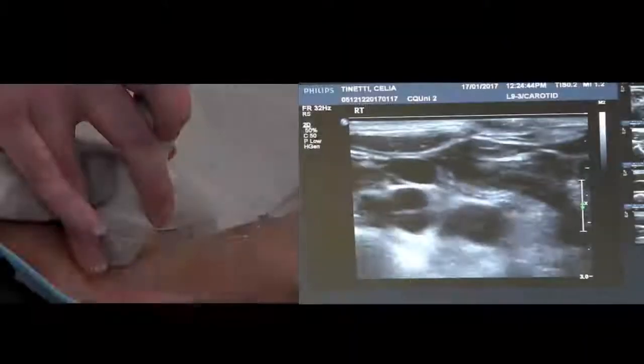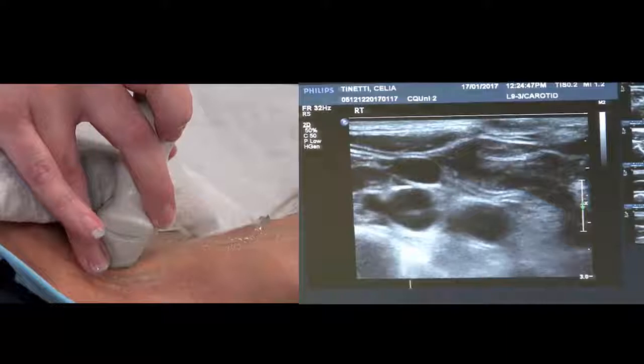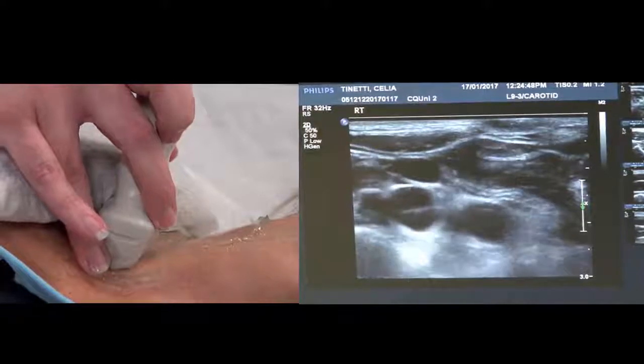This second video of the three will be continuing on from the first one. We've already done the surveys, looked in color, done the images — the B-mode images. This is just looking at the Doppler traces we're going to be doing for the carotid. So we're starting the Doppler traces, the spectral Doppler part, with the subclavian.